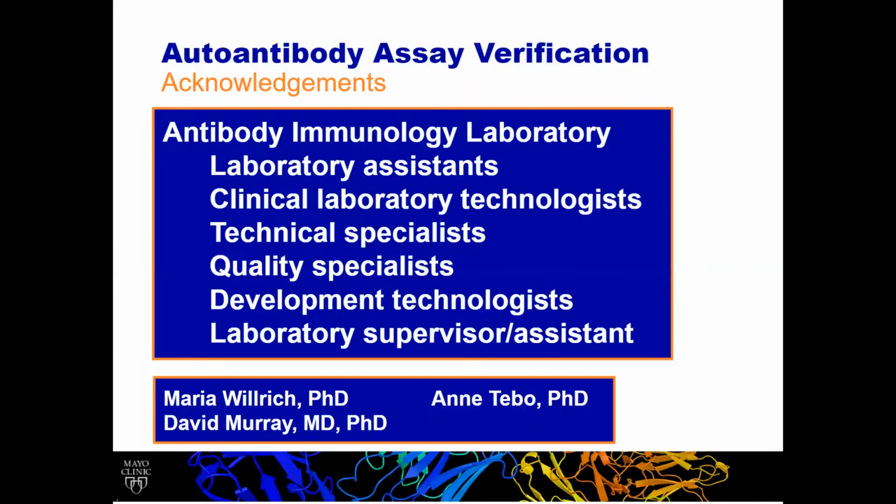In terms of which assay gives the better result, again, this is a very challenging question to answer. That's why we brought in that clinical analysis looking at the diagnosis for the patient. If I remember correctly, the result that I'm sharing there was actually a patient who did have rheumatoid arthritis. So at least the positive result was consistent with the diagnosis. But that's not always the case. And just because the patient doesn't have the diagnosis doesn't necessarily mean they don't really have that autoantibody. It's certainly possible that they do. Those are some of the thoughts we have to have whenever we're looking at these types of discrepancies.